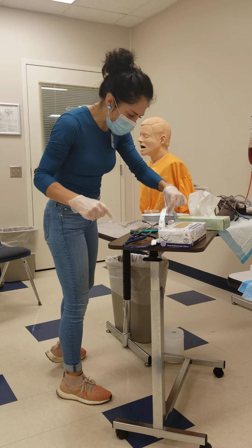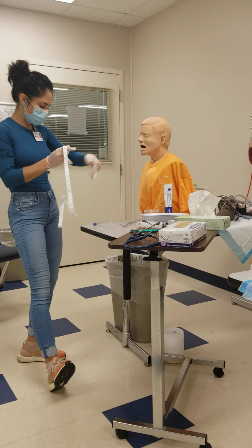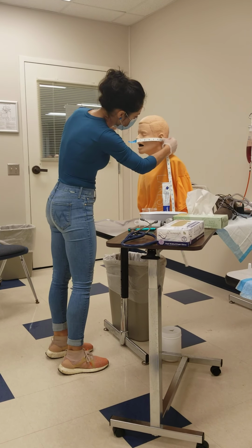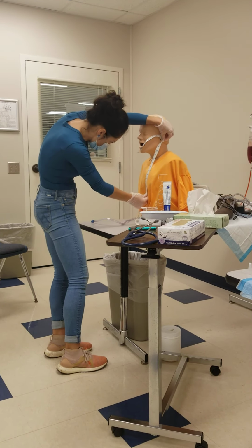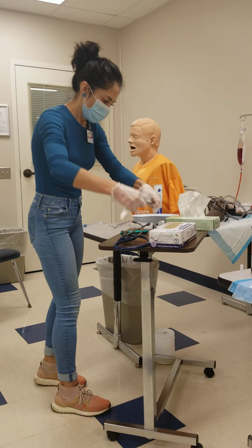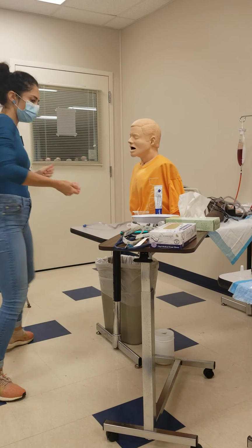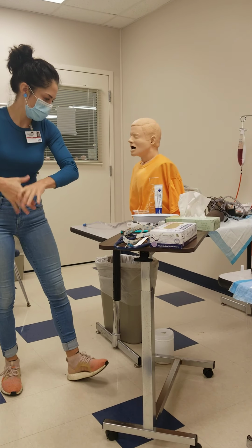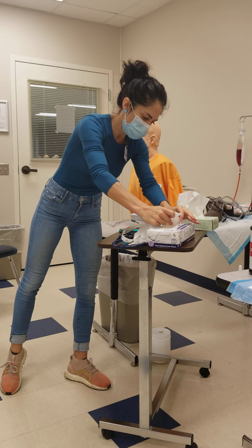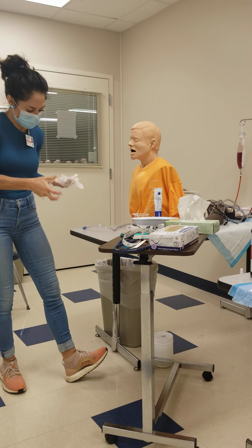So now next, to measure the length of the NG tube, we will be taking measuring tape. We will be starting from the tip of his nose to his ear and to the bottom of the xiphoid process. And I get 51 centimeters. And since I touched his face, I would like to change my gloves. I'm going to wash my hands here. Put a fresh pair of gloves on. So I said 51 centimeters.